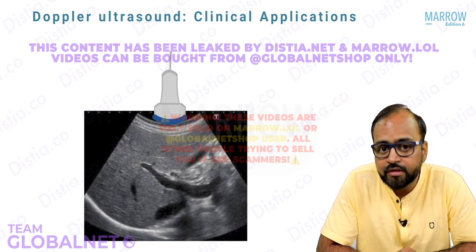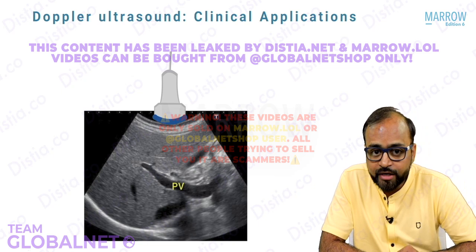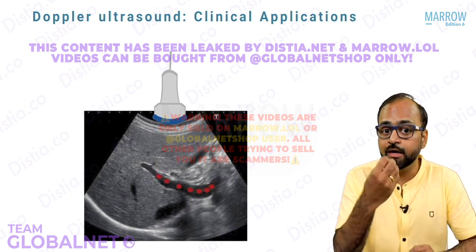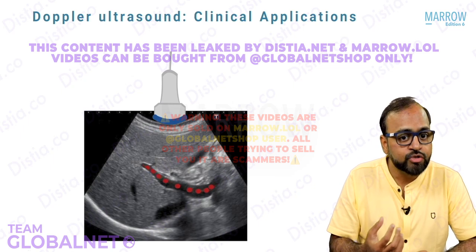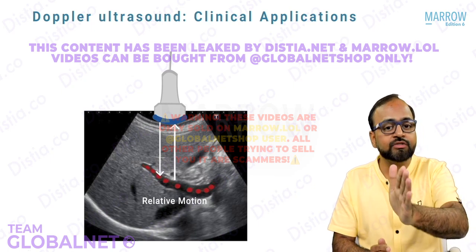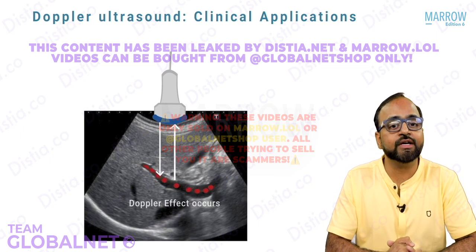But what will happen if now I try to evaluate the portal vein? Look, if I am trying to evaluate the portal vein, inside the portal vein blood is flowing. Blood predominantly consists of RBCs. Each RBC is a reflector of ultrasound. All the RBCs are moving. So now when a pulse is emitted and an echo is received, there is relative motion between the ultrasound probe and the blood or the RBCs which are moving. And therefore Doppler effect comes into play.